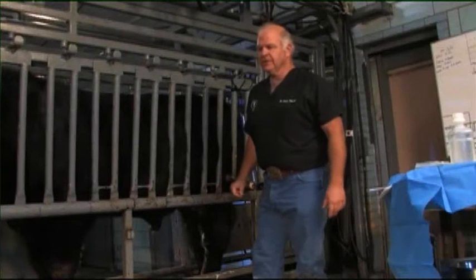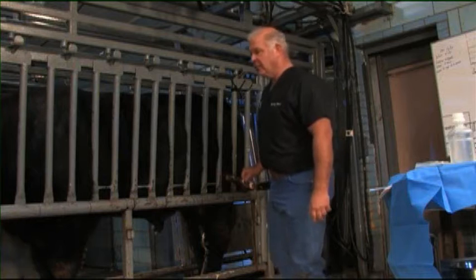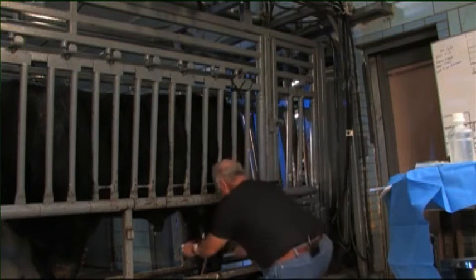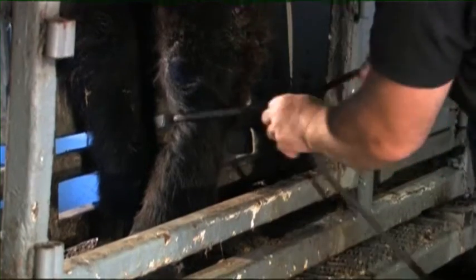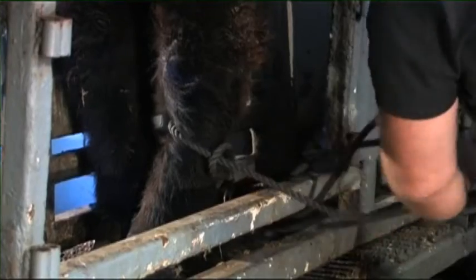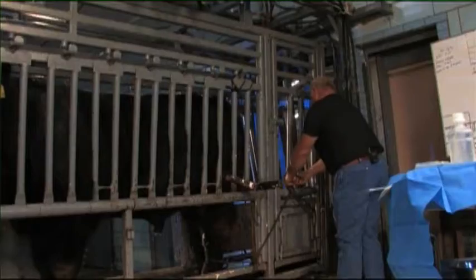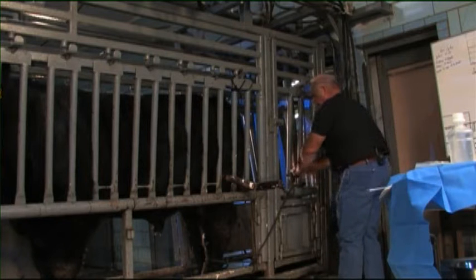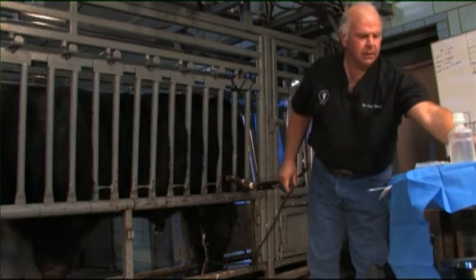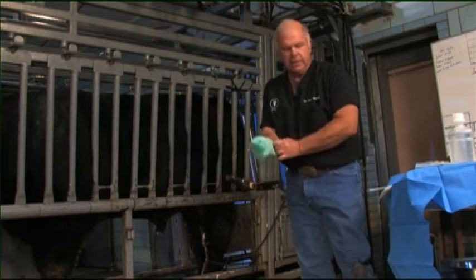Once we have the animal in the squeeze chute, we might want to consider restraint, particularly for those animals that are a little intractable, for both the protection of the individual as well as the collector. Next, we'll put on a pair of disposable latex gloves.